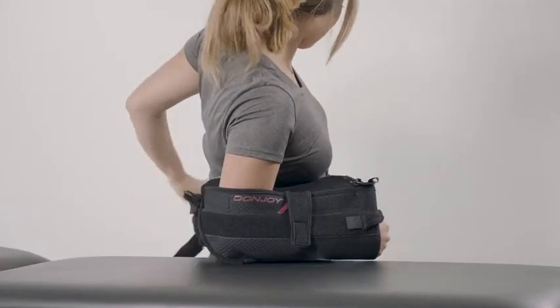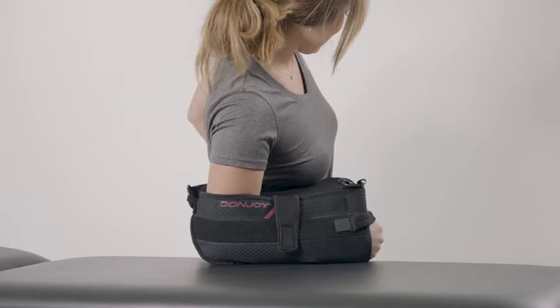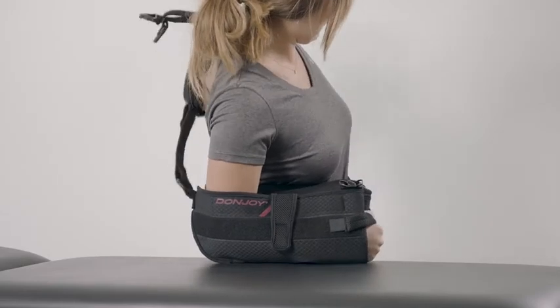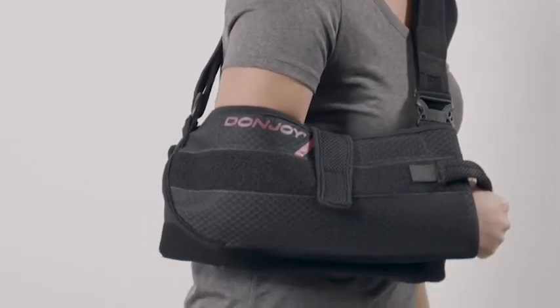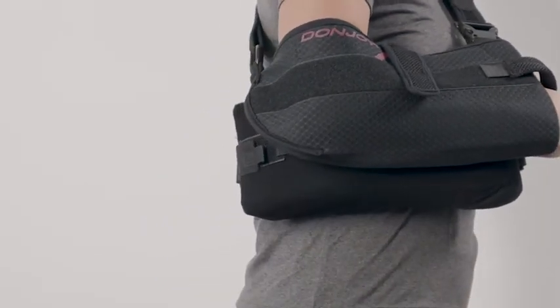Next, bring the shoulder ring around the back and slide the healthy arm through the ring. Reattach the quick release buckles at front of arm sling. Check to make sure the cushion is in proper position and elbow is at 90 degrees.